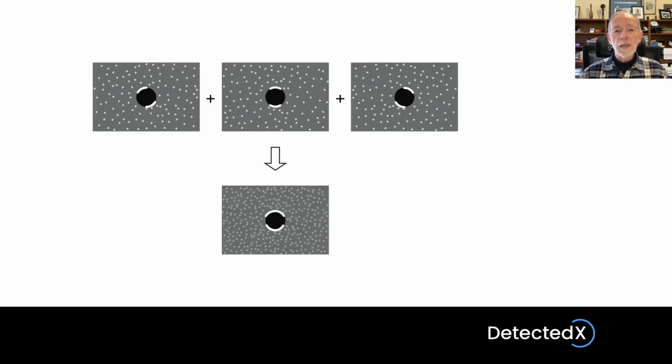This illustrates the idea that we will have multiple images, each of them different, and they will then be added together to produce the final compound image. Notice that the speckle pattern in each of these is different, and so when they are averaged together to produce the final image, the speckle pattern will be finer and less pronounced.